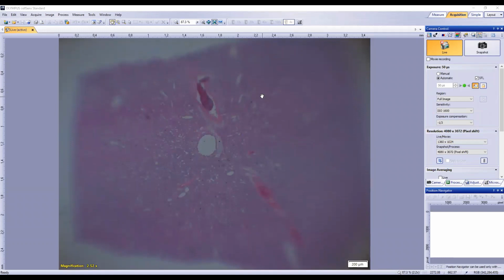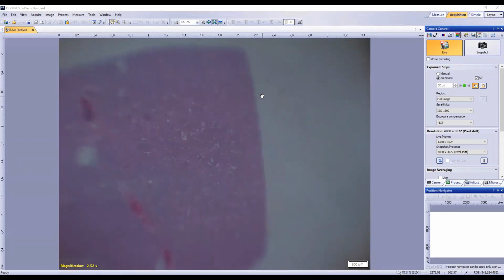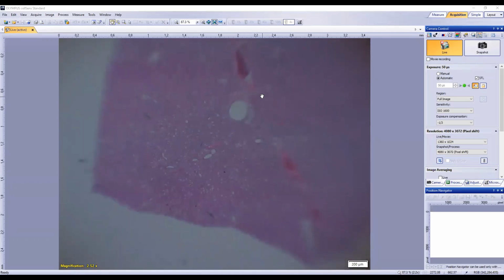And I'm looking for one more thing that we can tell. It's out of focus at the moment, but we can move the slide around on the stage a little bit. Okay, Penny, we've got distended lymphatic vessels. So unmute and talk us through your thinking there. Sure. It seems that there are the peribronchial lymphatic vessels and periarterial ones, and they seem to be distended with this amphophilic material that's off focus now.